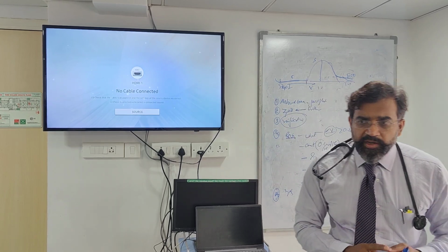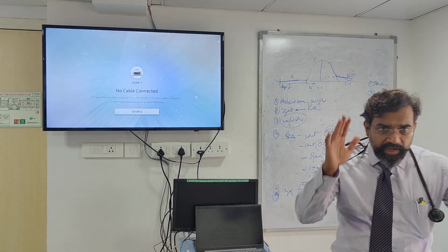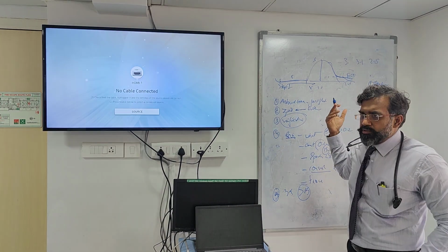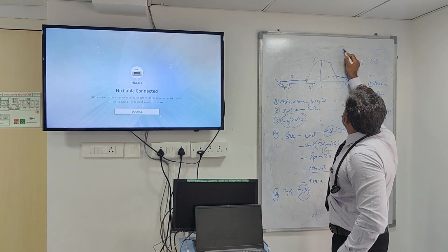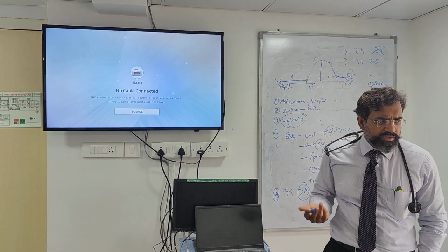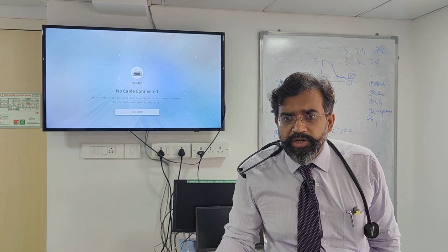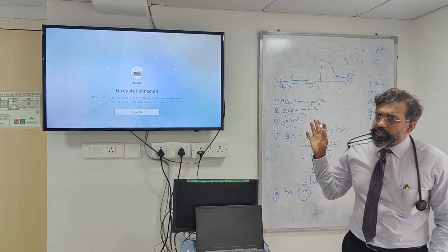If it is not varying more than 15%, then I would accept those traces. So if it is 3, 3.1, 2.8, I can accept this because the variation is not more than 15%. But if it is 3, 2.4, 2.1, I cannot accept this reading. If I am doing 3 readings and I am not getting it within 15% of each other, I will do a 4th reading, a 5th reading. I will do multiple readings to get my precision right.